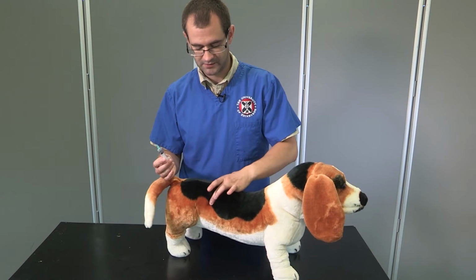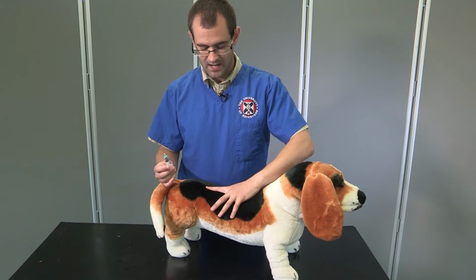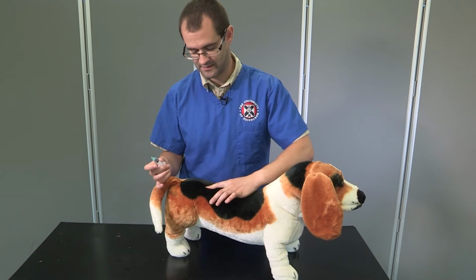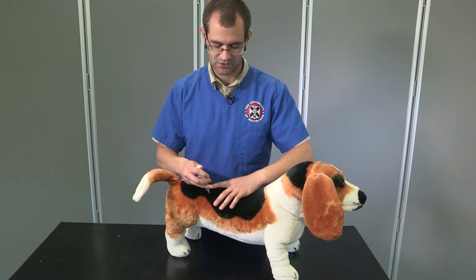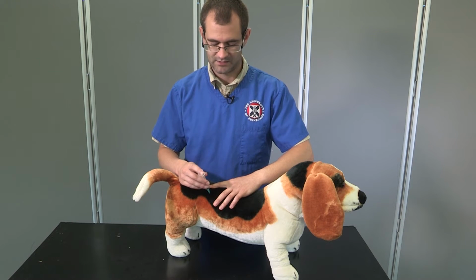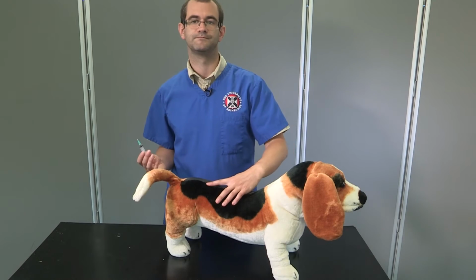Again, needle and syringe. What we want to do is palpate the musculature either side of the spine. I personally tend to keep a finger on the spine to ensure I know where it is at all times, and then aim to one side, introduce my needle in there, draw back to make sure I'm not getting any blood back, and then inject and withdraw.